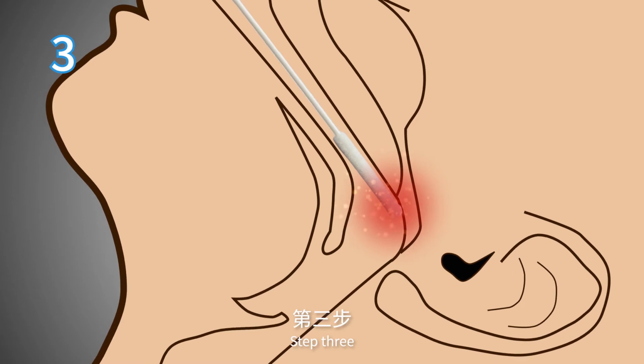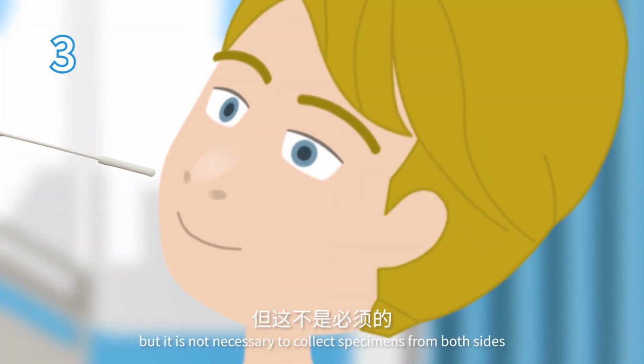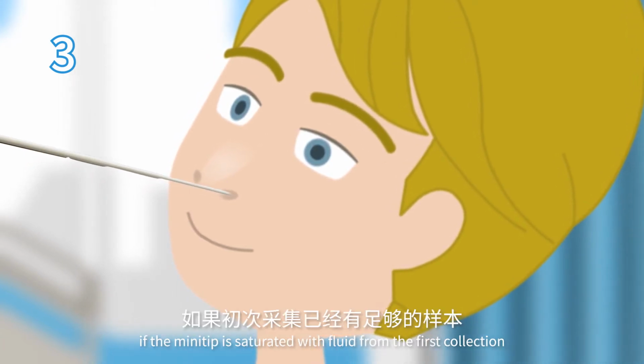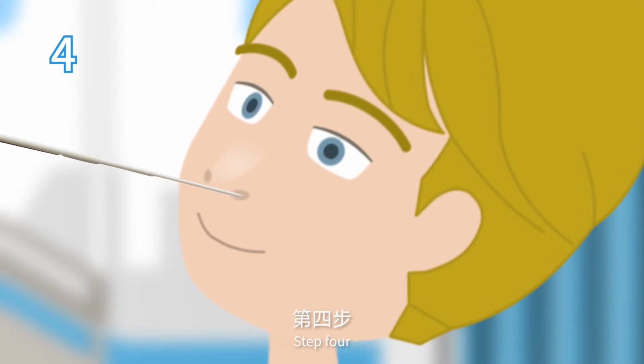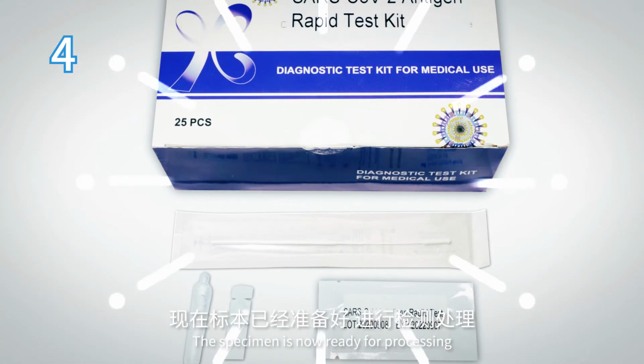Step 3. Specimens can be collected from both sides using the same swab, but it's not necessary to collect specimens from both sides if the mini-tip is saturated with fluid from the first collection. Step 4. Remove the swab from the nasal cavity. The specimen is now ready for processing.